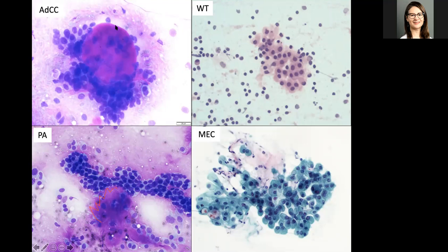Whereas in the adenoid cystic, it's this so-called gumball, right, with a very, very round rim. And so if the characteristics of the stroma or the cells are not clear, one might say, all right, this is a basaloid salivary gland neoplasm, but I can't tell pleomorphic adenoma versus adenoid cystic. In this case, the characteristics of the stroma are such that we can favor one over the other.